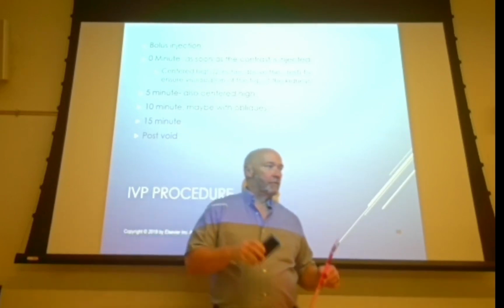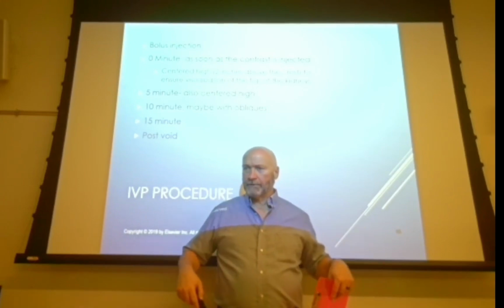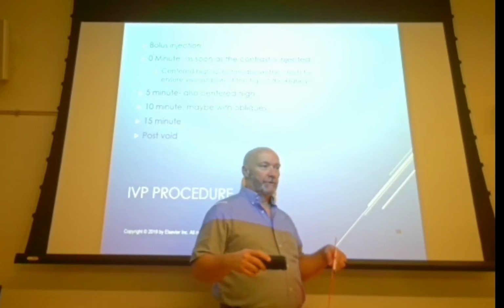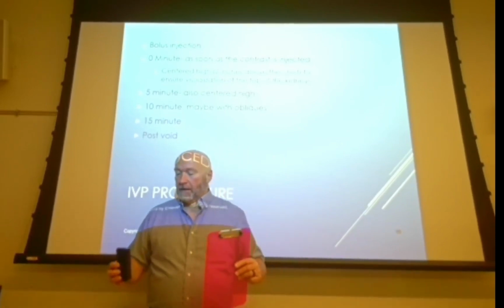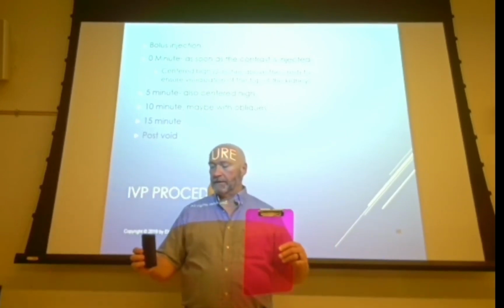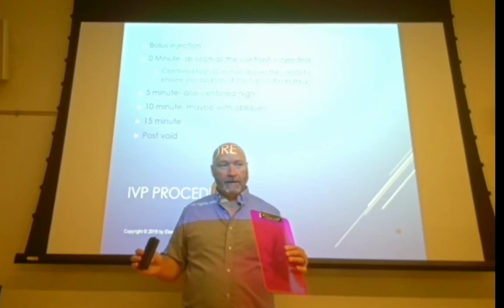It's kind of like the obliques of the pelvis when we went through the pelvis last semester. You remember, you can see in the Judet views, you can see the entire pelvis, if you opened up your collimator and shot it like a pelvis, right? So the kidneys, again, are positioned where the superior pole is posterior and they're at an oblique angle like this.